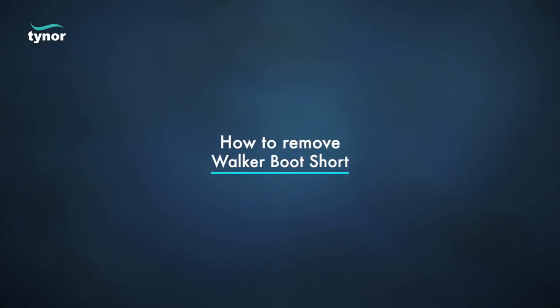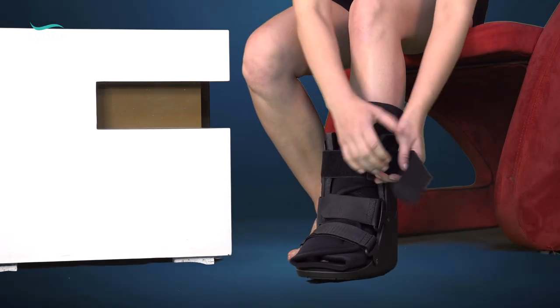Now let us see how to remove the walker boot short. Unfasten the fasteners to easily remove.